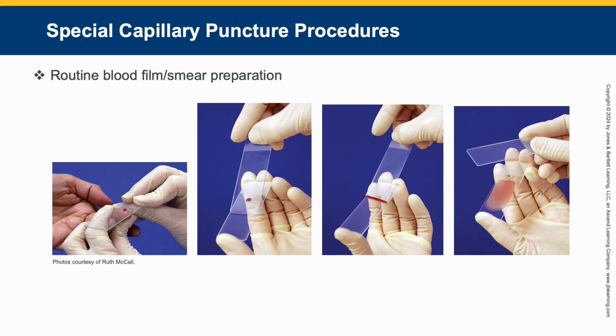Before you leave the patient, check their puncture site, apply the Band-Aid, discard the materials, thank the patient or the guardian of the baby, remove your gloves, sanitize your hands, and take it back to the lab.